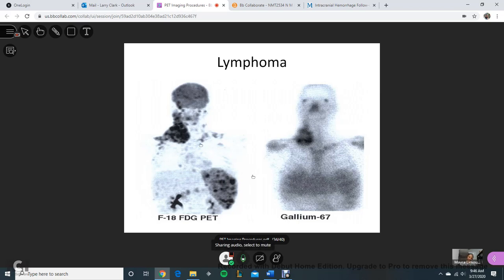Well, you can kind of see the liver. This is the liver. This is the base of the liver. This is the dome of the liver right here. And then the kidney, and this kidney sits a little bit lower only because the spleen is so large. And the heart's here. Can you guys see my drawing or no? Yeah. Okay.